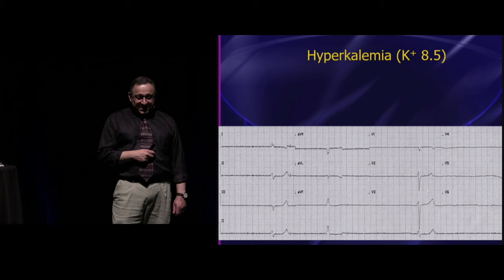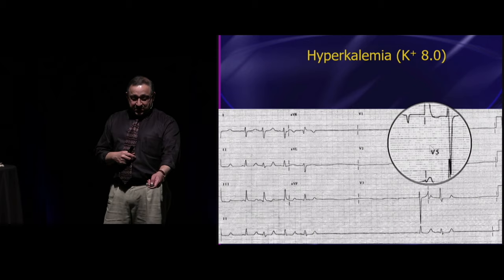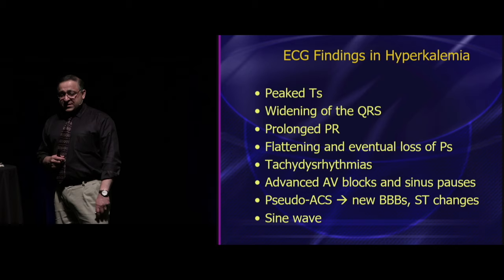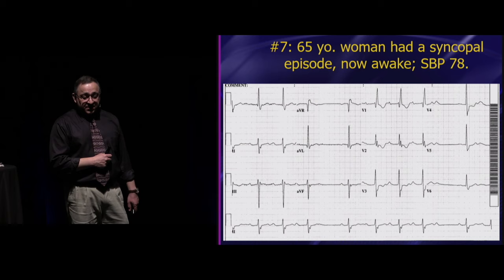This is not at all classic hyperkalemia on the EKG, yet this is classic in terms of what you're going to see. Take a look at the sinus pause on this one, all right? Big time sinus pause, and there's your only peaked T wave in that one impulse right there, right? And the QRS complexes are really not that wide. This is all classic. So please be on the lookout for these patients that are coming in with strange bradycardias associated with hyperkalemia. It's really, really common. And unfortunately, it's just not commonly taught, all right? Questions about hyper-K?